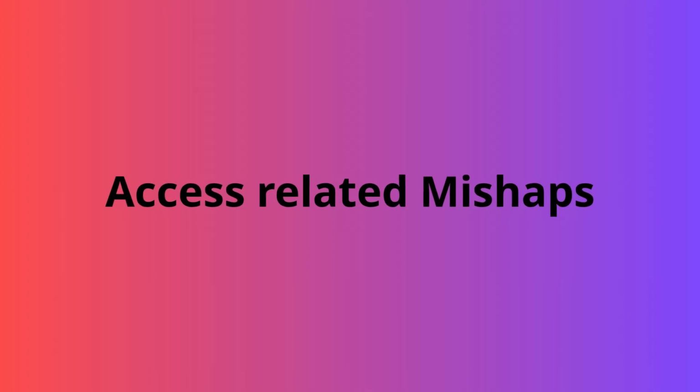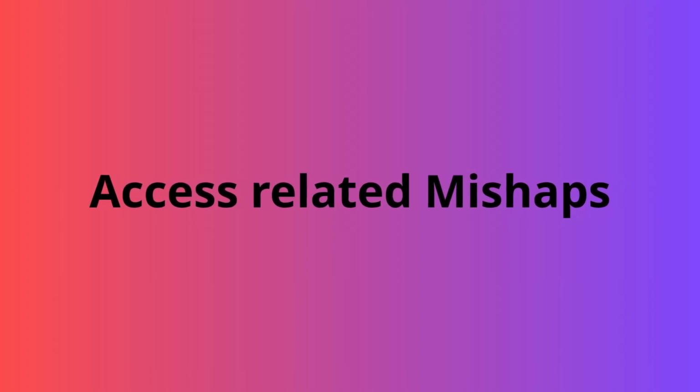Let's dive into the first major category of endodontic errors, access cavity mishaps. Now, the access cavity is literally your gateway into the root canal system. If it's not done correctly, you're setting yourself up for a chain of complications. Let's go through the most common mishaps in this step.